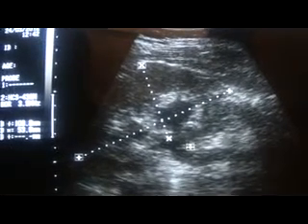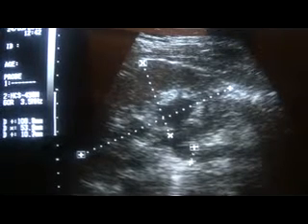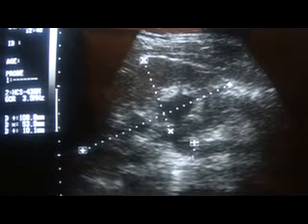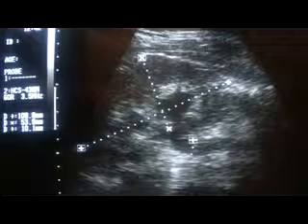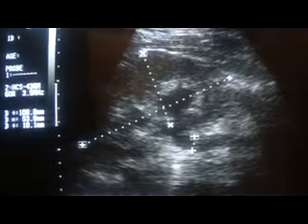So while taking the anterior-posterior diameter, which is the most important diameter in case of kidneys as compared to the length of it, take it from the prone position if possible.